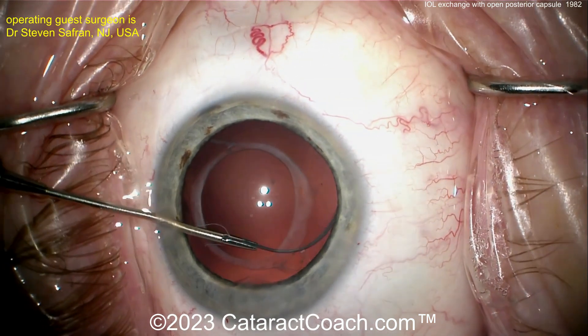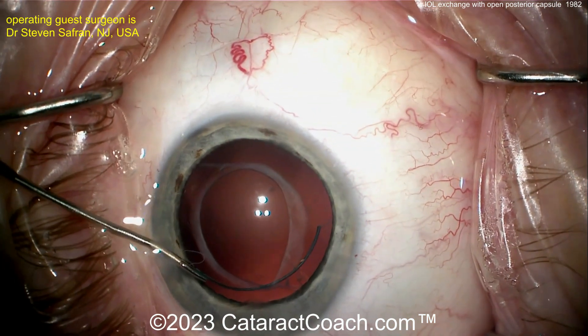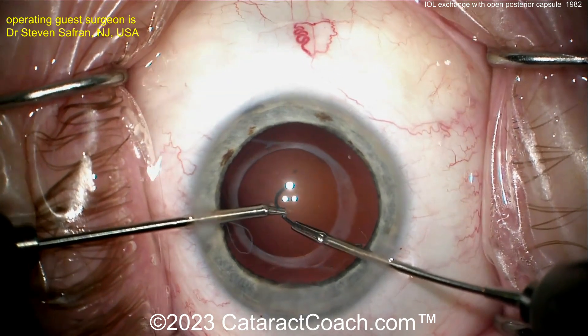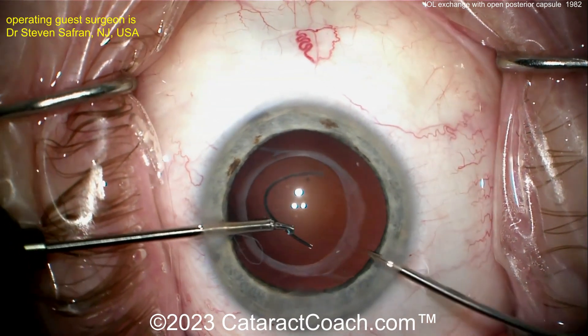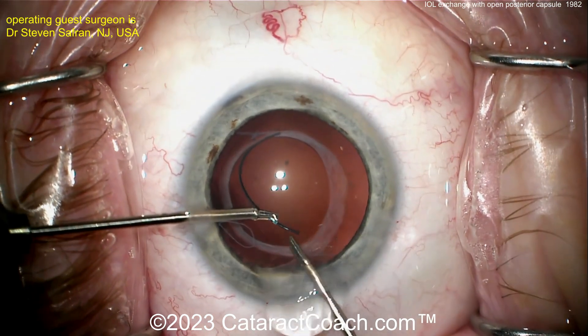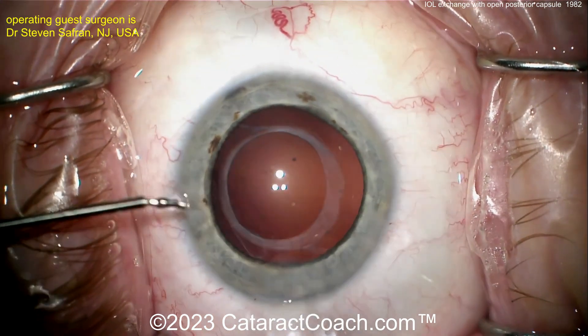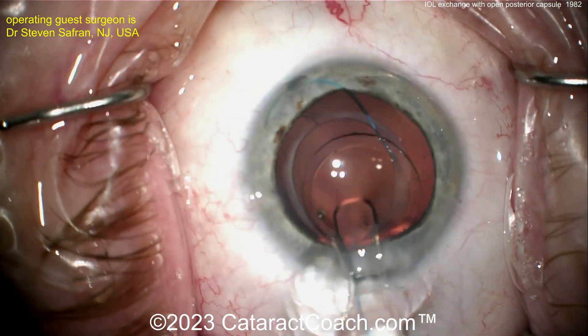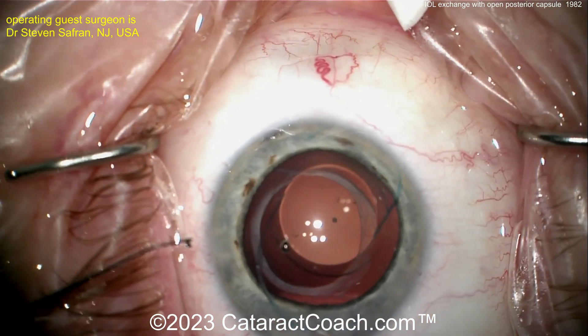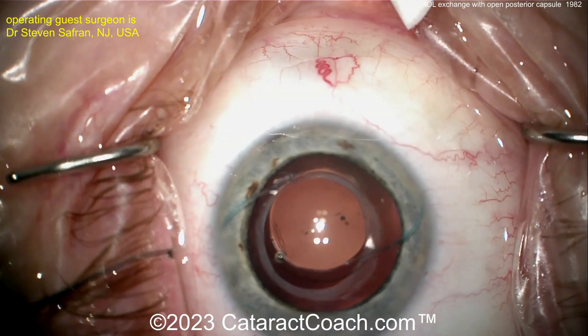Now let's try to remove the haptic that was amputated earlier. It can be pulled out gently without causing damage to the zonular support — and that support will be needed for placing the new lens. Just hand over hand, feeding it outside the eye. Now it's out and the eye is cleaned up.